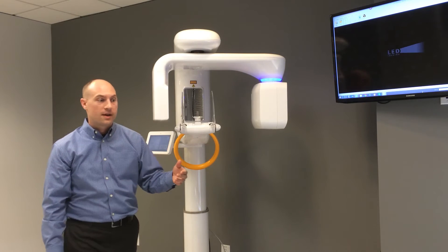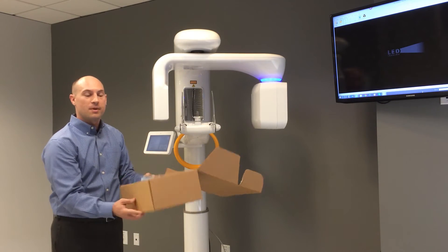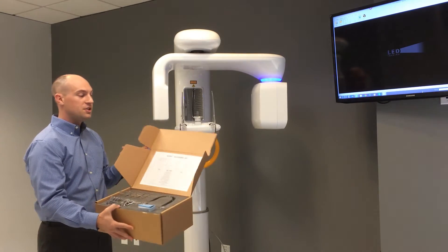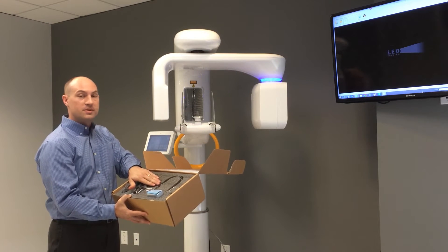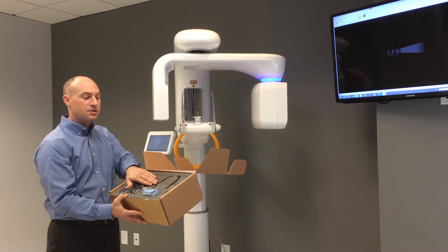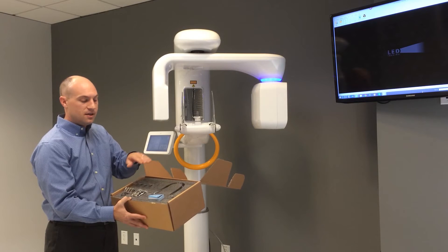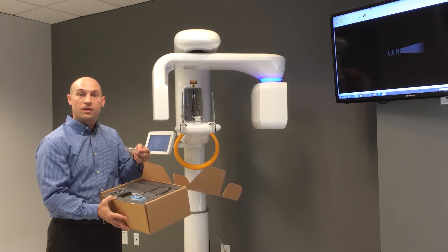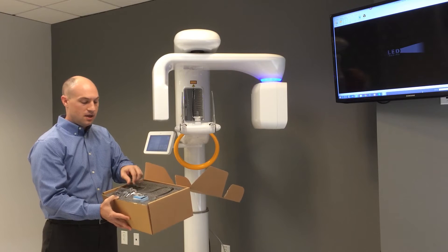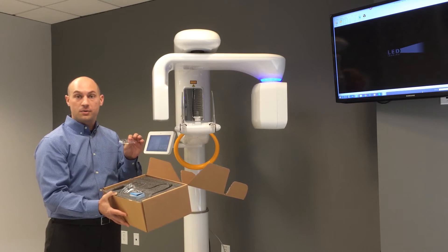With the machine itself we also have positioning accessories that come with every machine, typically in a brown box with a cheat sheet on the inside of the cover. These include additional temple supports for a 2D TMJ shot, additional bite sticks, disposable bite sheets, a chin cup for an edentulous patient or a 3D TMJ acquisition, and a chin rest for a sinus 2D acquisition.